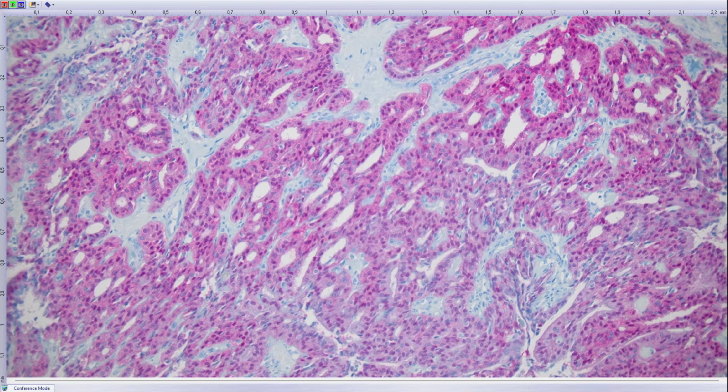This is the same malignant tumor as papillary carcinoma of the thyroid. Yeah, it's a quite rare tumor. Even if I say that I saw 5 or 6 cases in 2 years, this is the case I saw after many, many years.